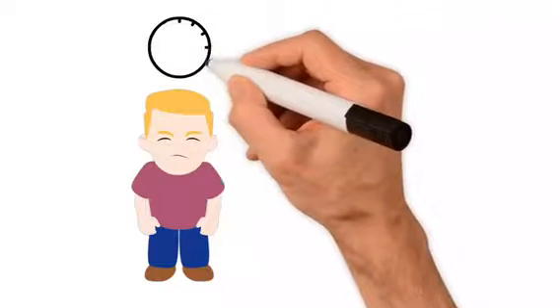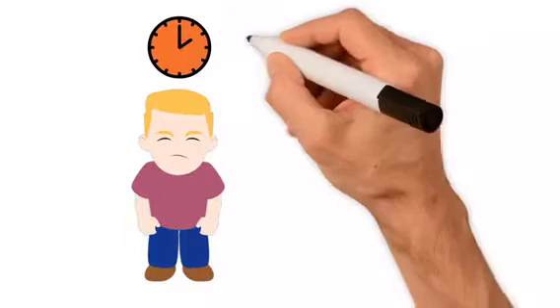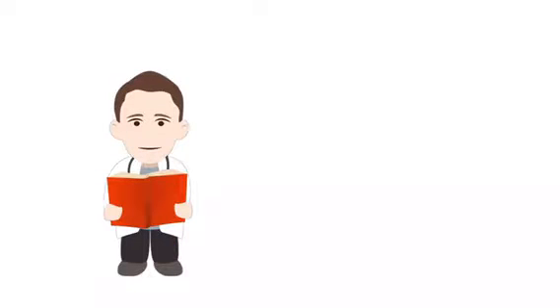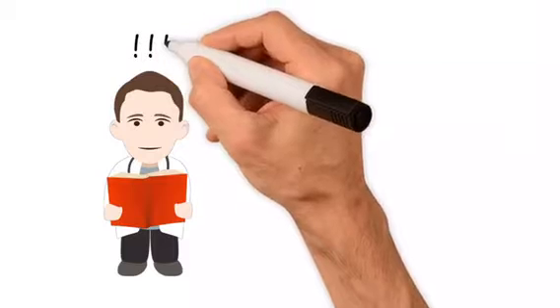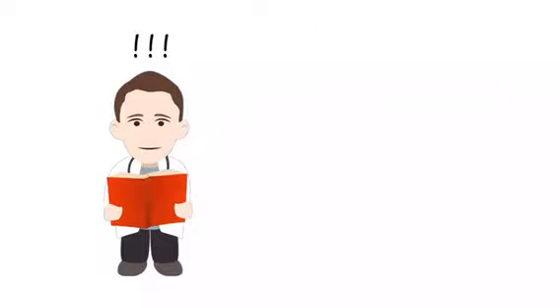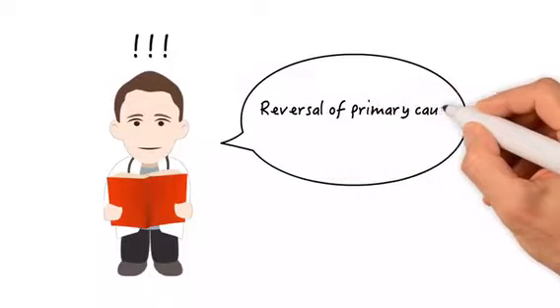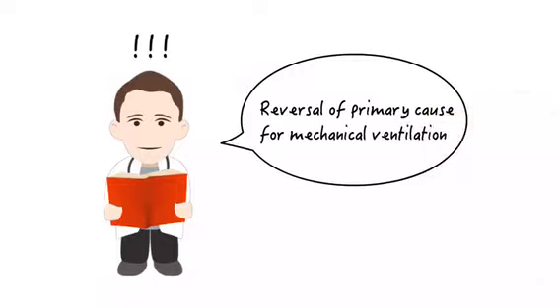Once our patient is on a spontaneous breathing trial for 30 minutes to 2 hours, it's time to monitor weaning parameters that will help guide the decision of extubation. Now, before moving forward, according to evidence-based practice, we should always note that the single most important criterion to consider when evaluating for extubation is whether there has been significant alleviation or reversal of the primary cause for mechanical ventilation.